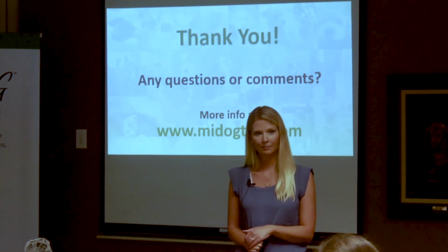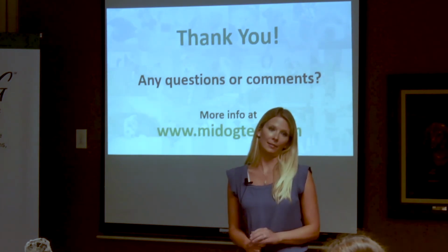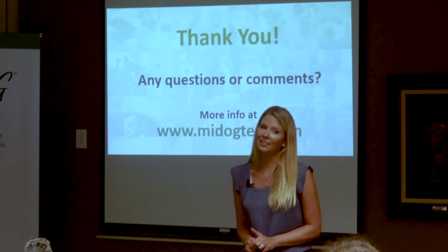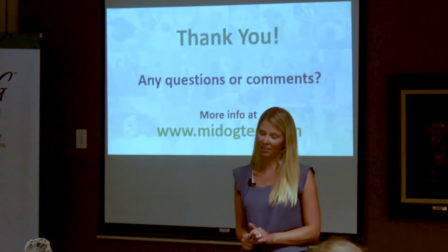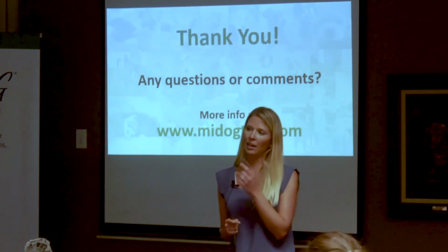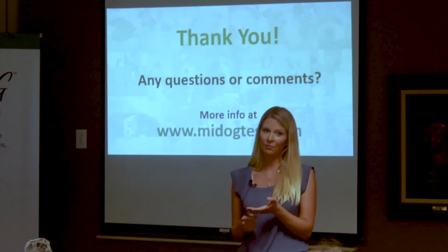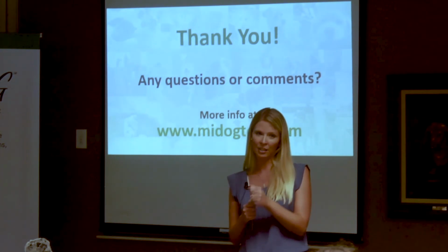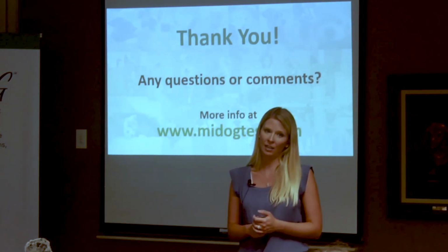You said something earlier about needing a larger volume of urine. How much do you need? Ideally, we would like to have at least 2 ml. I know it's not always possible, especially for cats, so we have a kit specifically for urine. The amount of buffer is very small, so the urine is not further diluted. Please use that if you can.